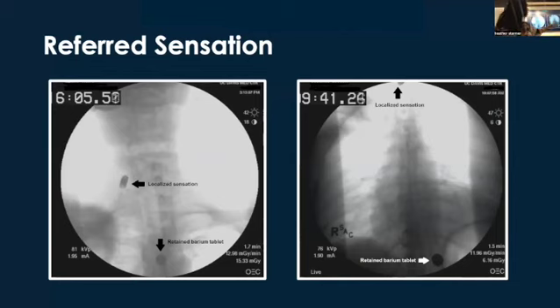On this further picture, we can see that that pill is retained all the way down by that lower esophageal sphincter, yet still that patient reports a more superior complaint for their dysphagia.